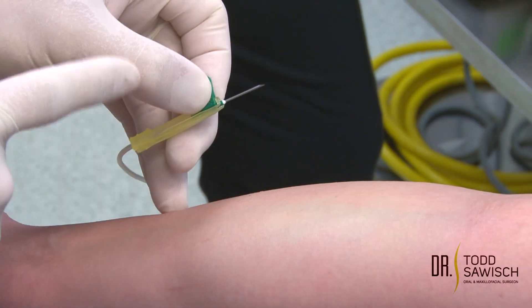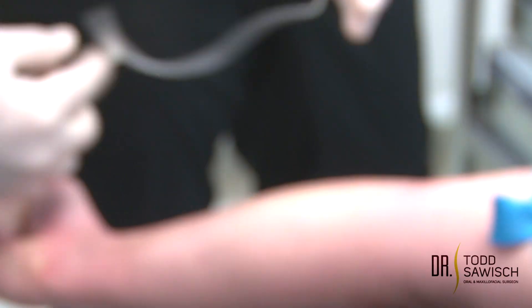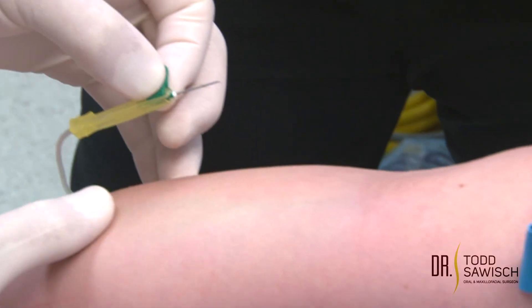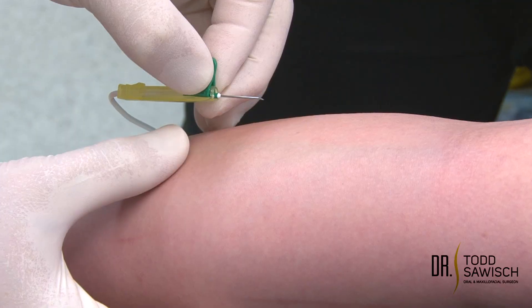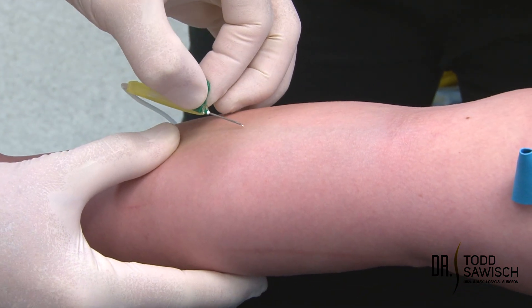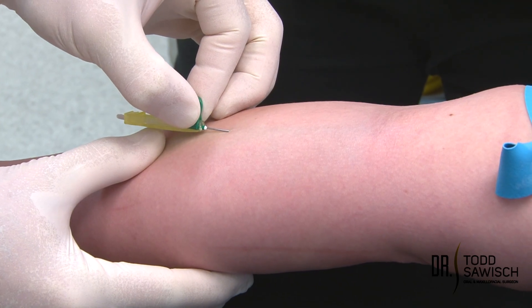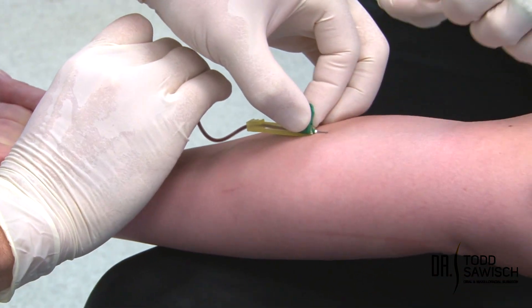My assistant is going to put tape on to secure it afterwards. I'm going to support the arm — I like to take my thumb and pull down on the skin to create some tightness so that when I penetrate through the skin it holds the vein steady. Insert at 15 to 20 degrees into the vein, and you will see the flashback coming through the tube.